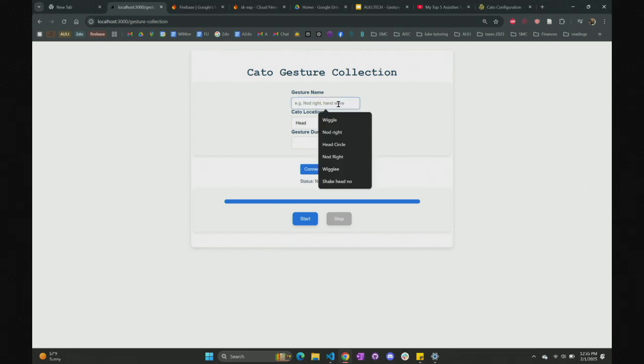Little bit of audience participation. Is there any particular head gesture you would like me to record live right now? Any head gesture? A nod. Okay, I see a nod. So we're going to do yes nod. You can personalize the names, so let's call it yes nod.